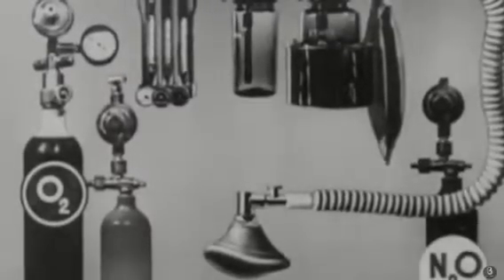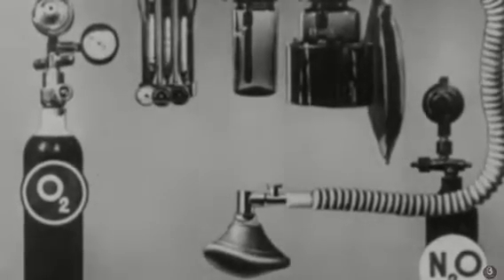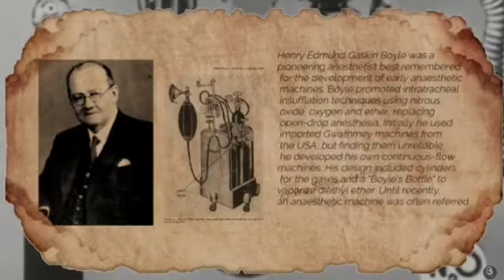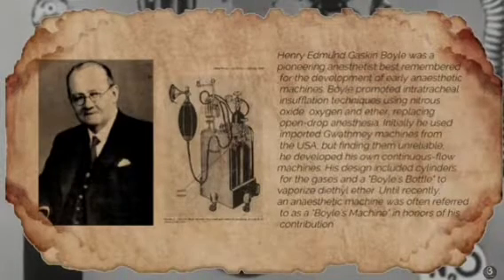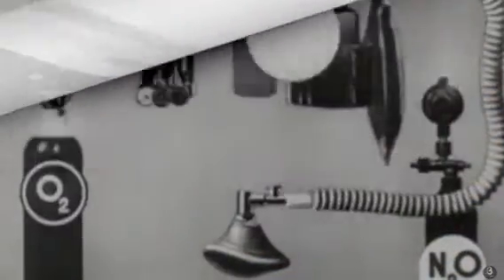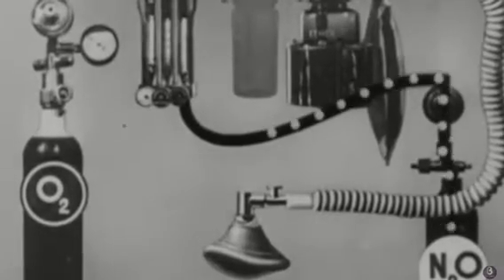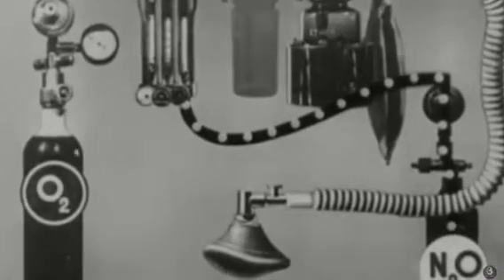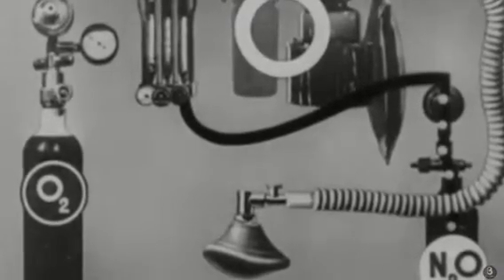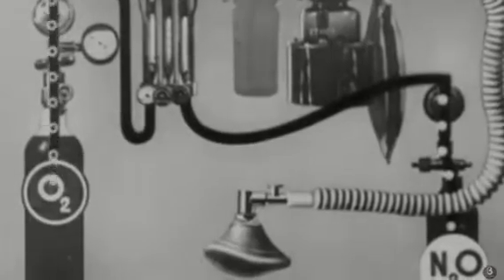The original concept of the continuous flow machines was popularized by Boyle's anesthetic machine, invented by the British anesthetist Henry Boyle at St. Bartholomew's Hospital in London, United Kingdom in 1917, although similar machines had been used in France and in the United Kingdom. Prior to this time, anesthesiologists often carried all their equipment with them, but the development of heavy, bulky cylinder storage and increasingly elaborate airway equipment meant that this was no longer practical for most circumstances.